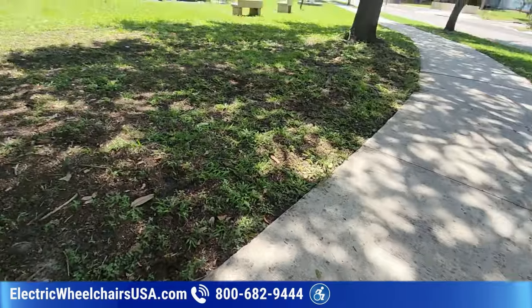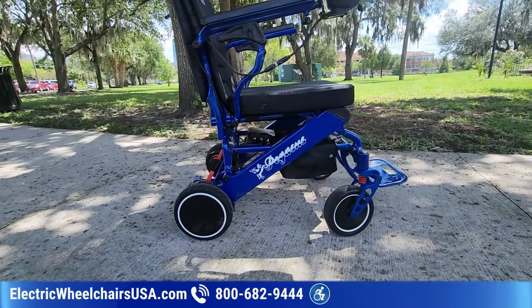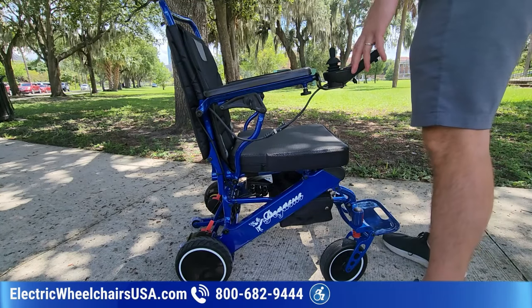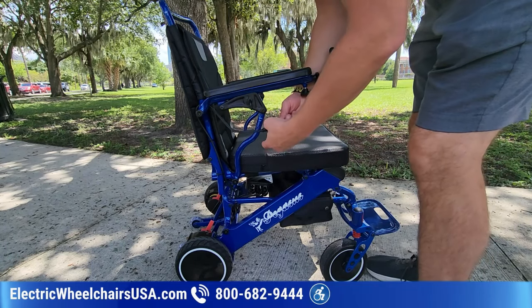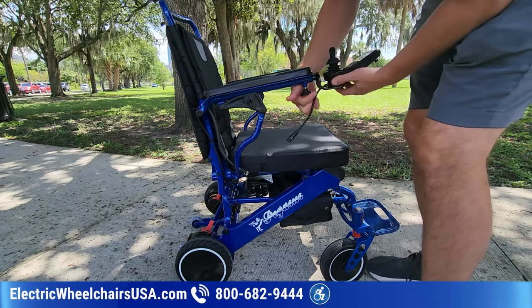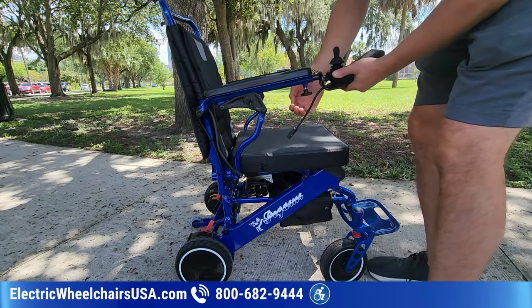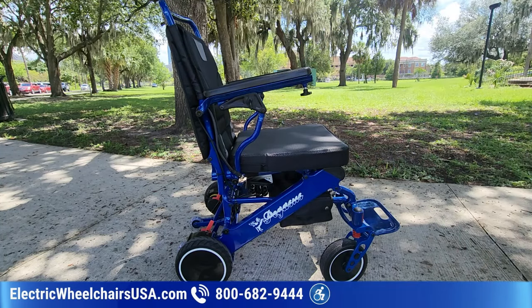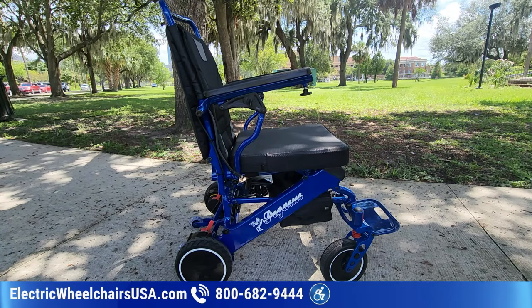And another cool thing, I like to show this too. Because this chair is airline approved, I think this is really nice to have. Not a lot of electric wheelchairs have this, but when you're traveling with the airline, they're going to require you to remove the batteries and bring them on as a carry-on. And then you also, you don't have to do this, but I think it's important to take the joystick off, especially if you have the ability to disconnect it here like I just did. And then I can take the joystick off and then bring this as a carry-on, because you don't want to break this. So take the batteries off and this, and that's what is required to bring on as a carry-on.